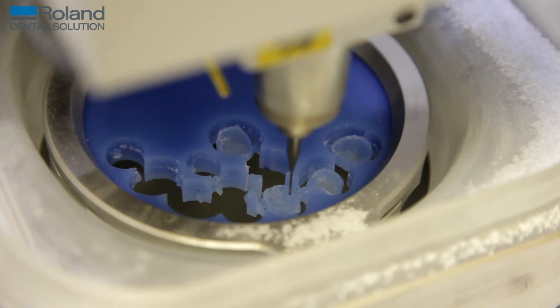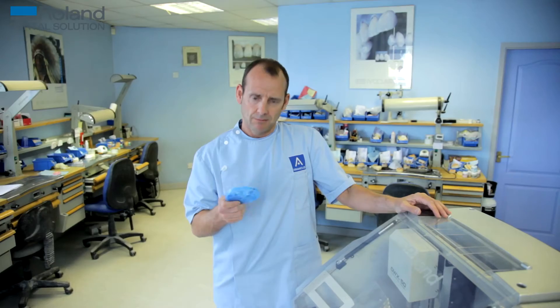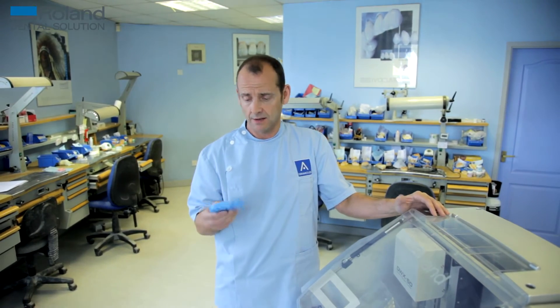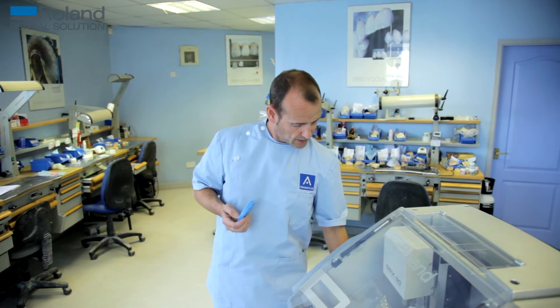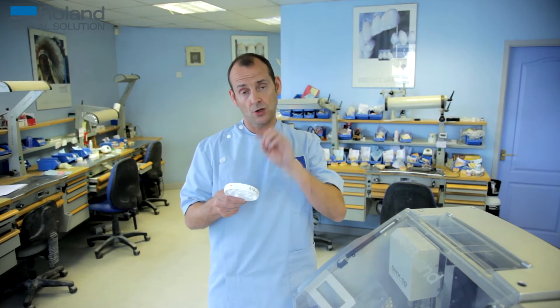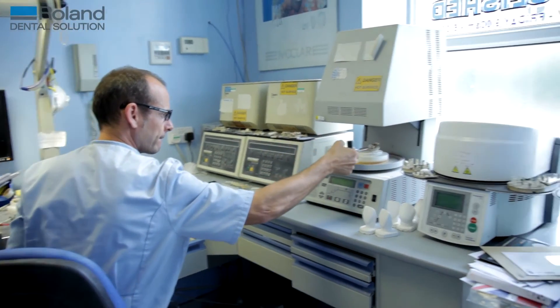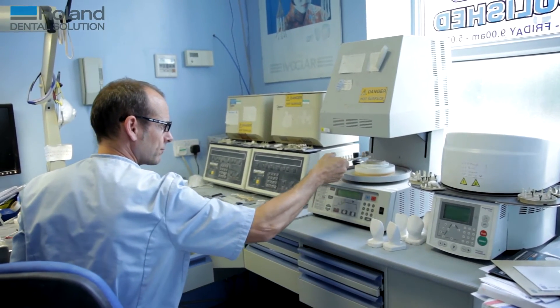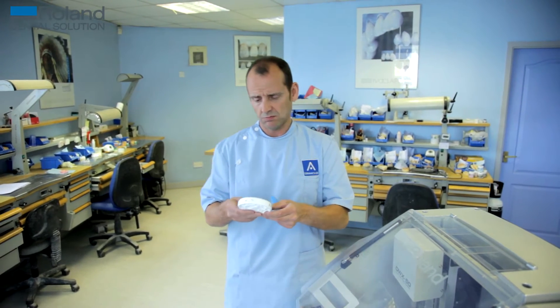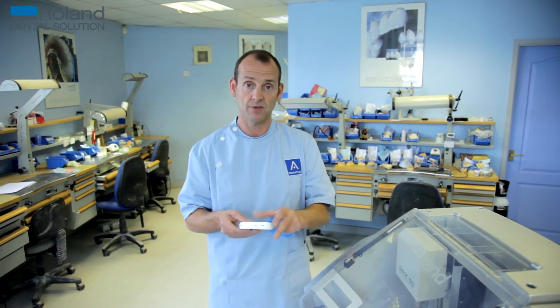You can pick up any disc and reuse it for whatever's left, so all your discs get fully used up — there's no wastage on the wax disc. We can fit about an average of 28 units on a wax disc, depending on whether they're molars or anterior teeth. On a zirconia disc you can fit about 22, because the zirconia ones are milled bigger than they need to be, and then when they're sintered — when they go in the furnace — they shrink back. Because they're bigger, obviously you can't fit as many in.